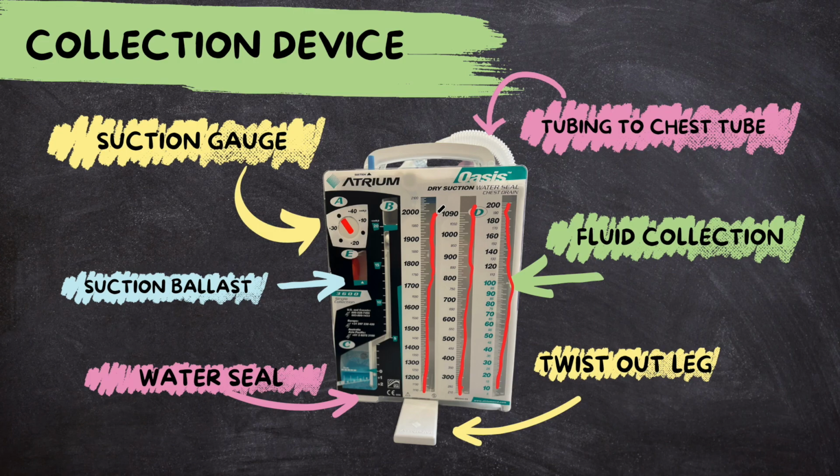So next, the part in the pink up top. You're going to notice you have a tube, and this is kind of tucked in the back of it. It's not very well visualized here. But this tube is what's going to connect to the actual chest tube that's in the patient. And it unfolds, and it's pretty lengthy once you get it undone.